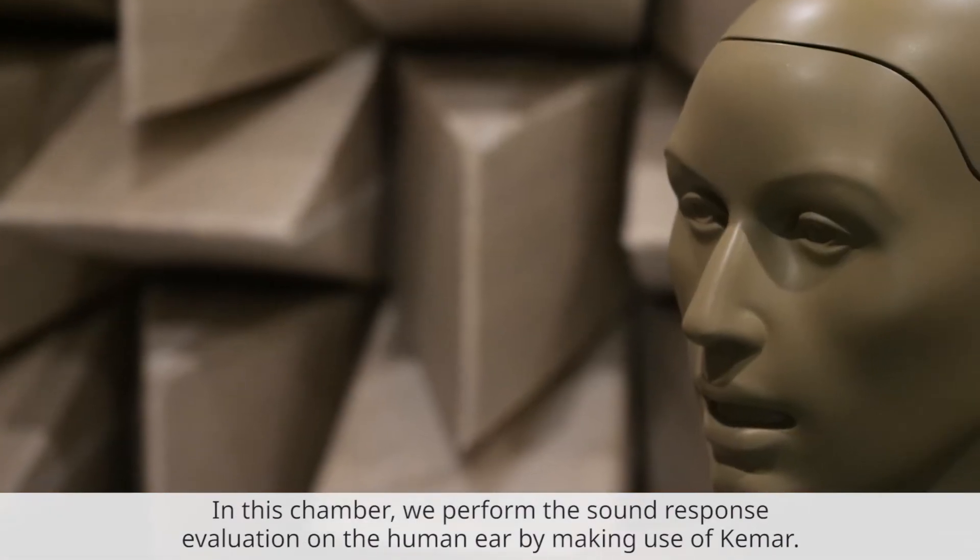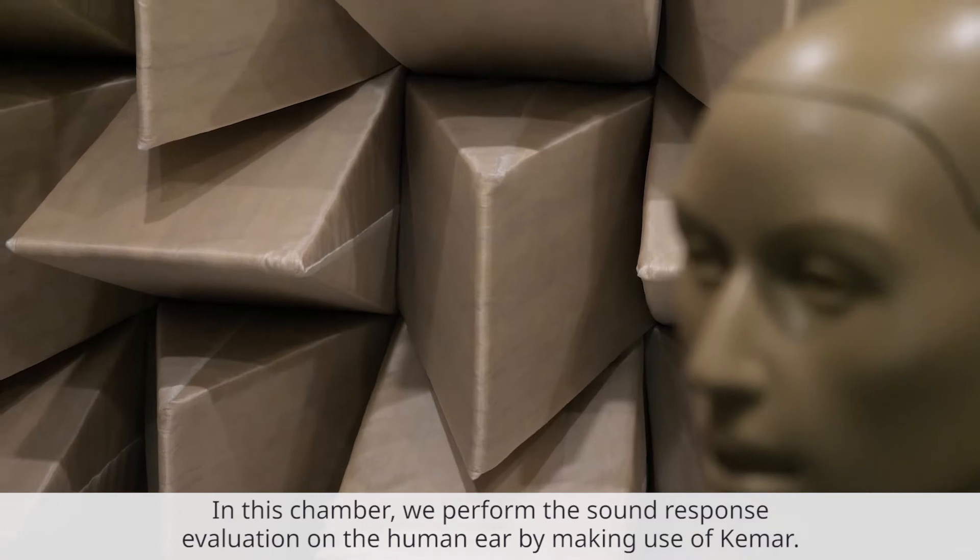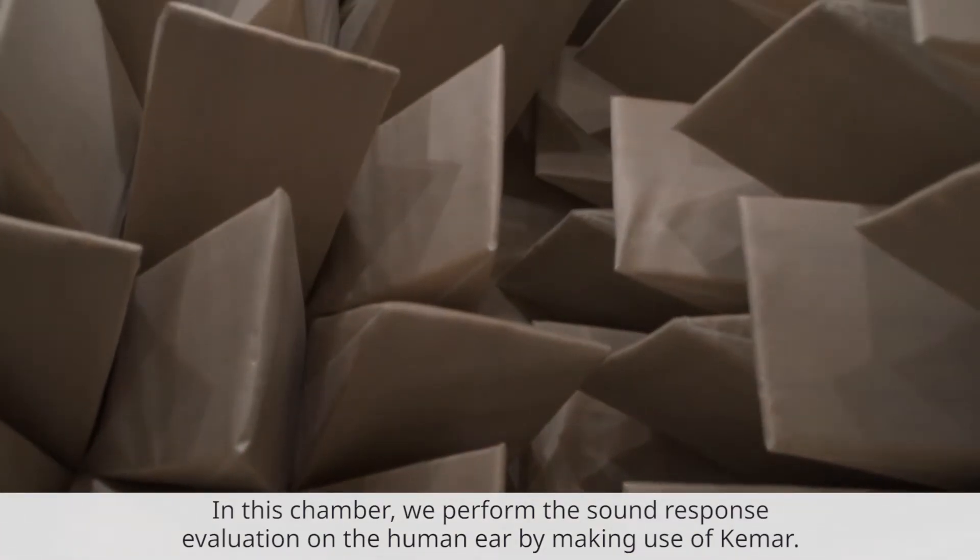In this chamber, we perform the sound response evaluations on the human ear by making use of this PINNA manikin.